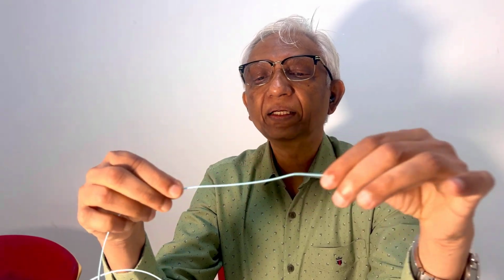So there are many ways in which catheters are created. For example, this catheter that we see over here is braided.